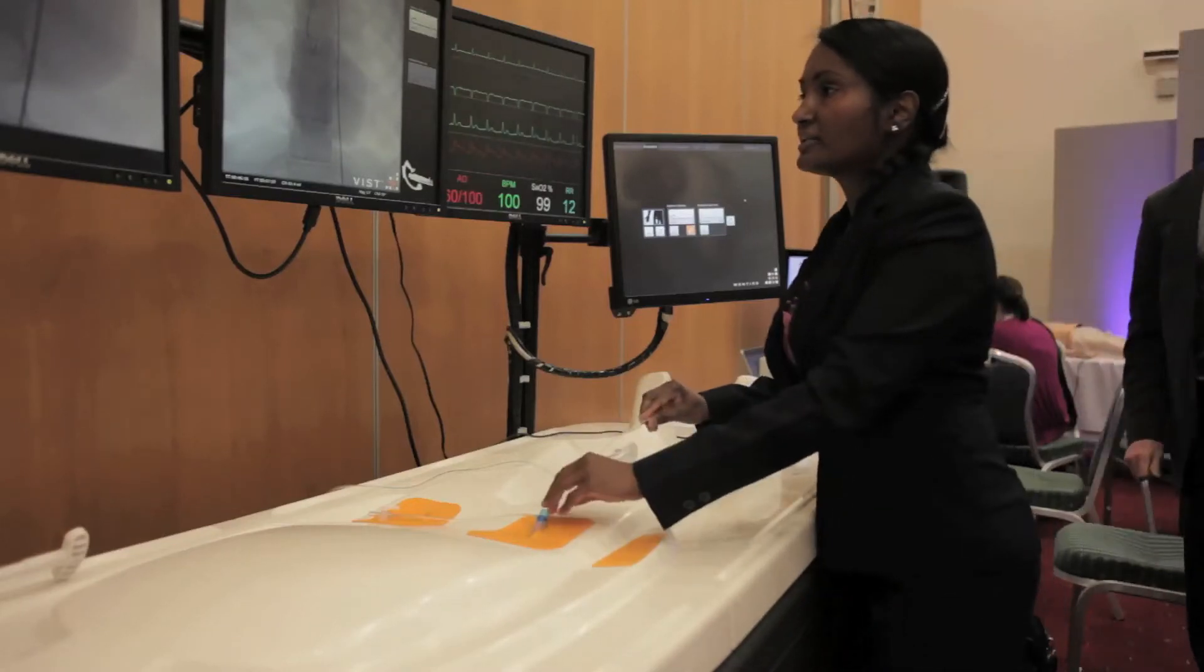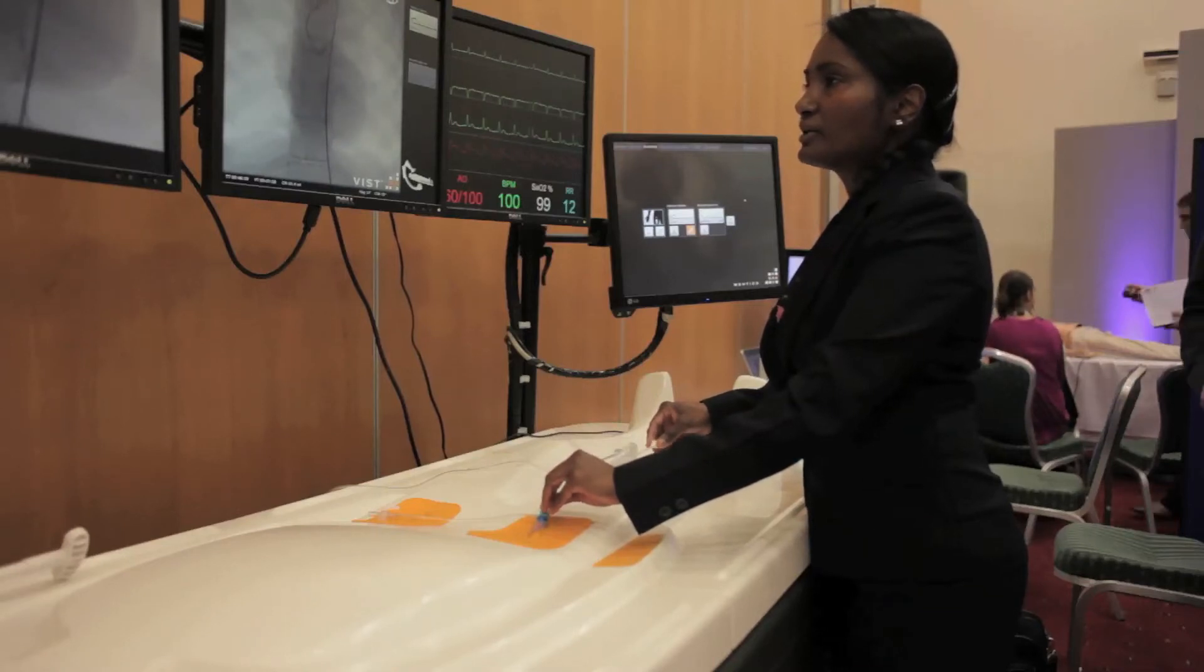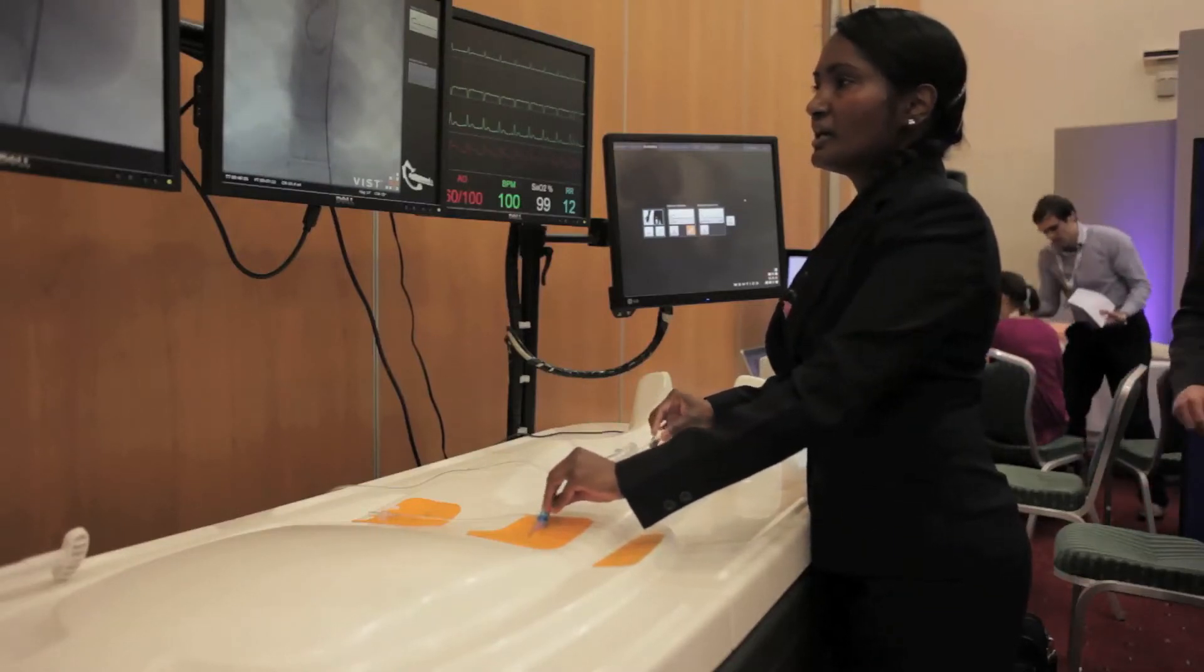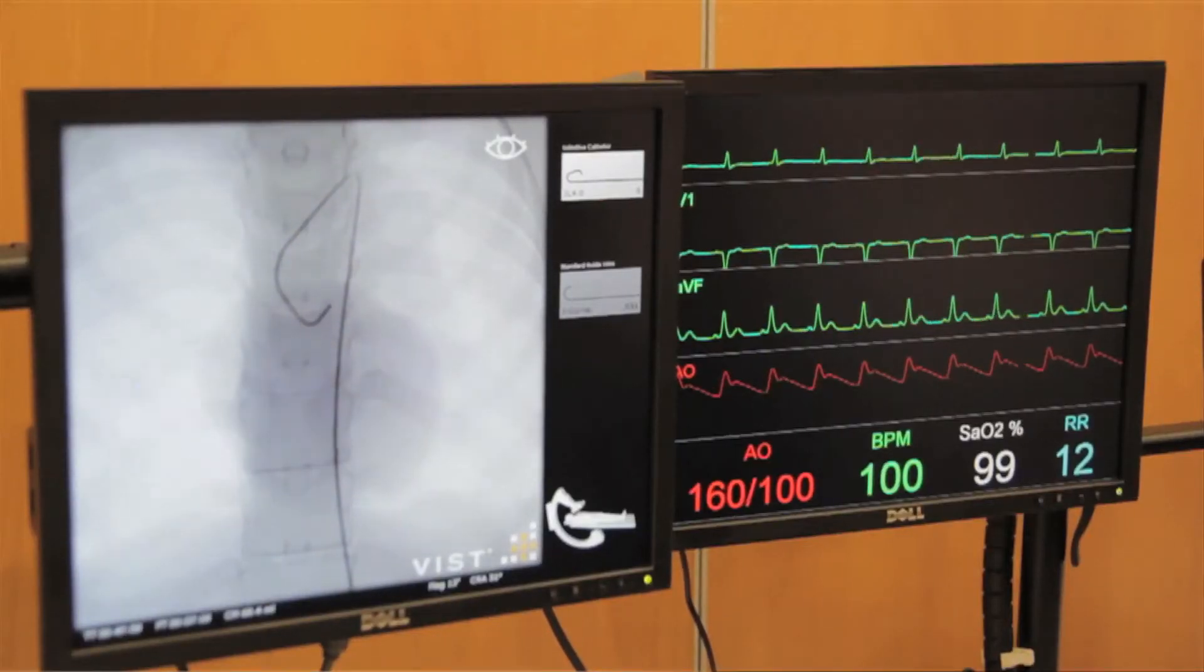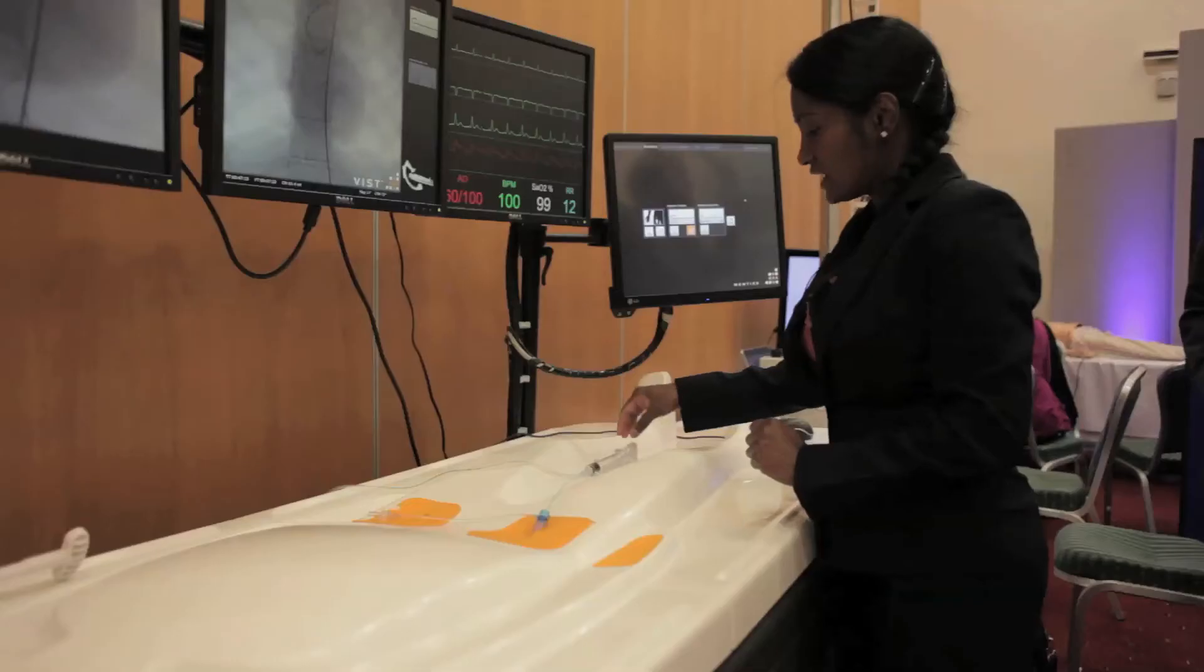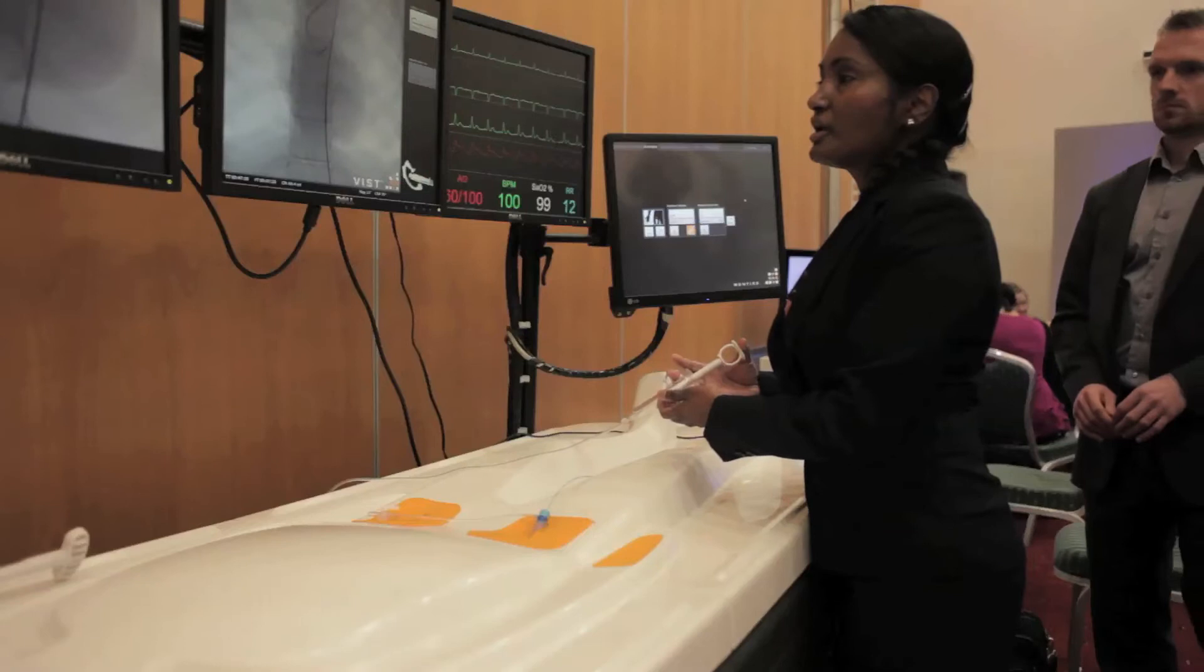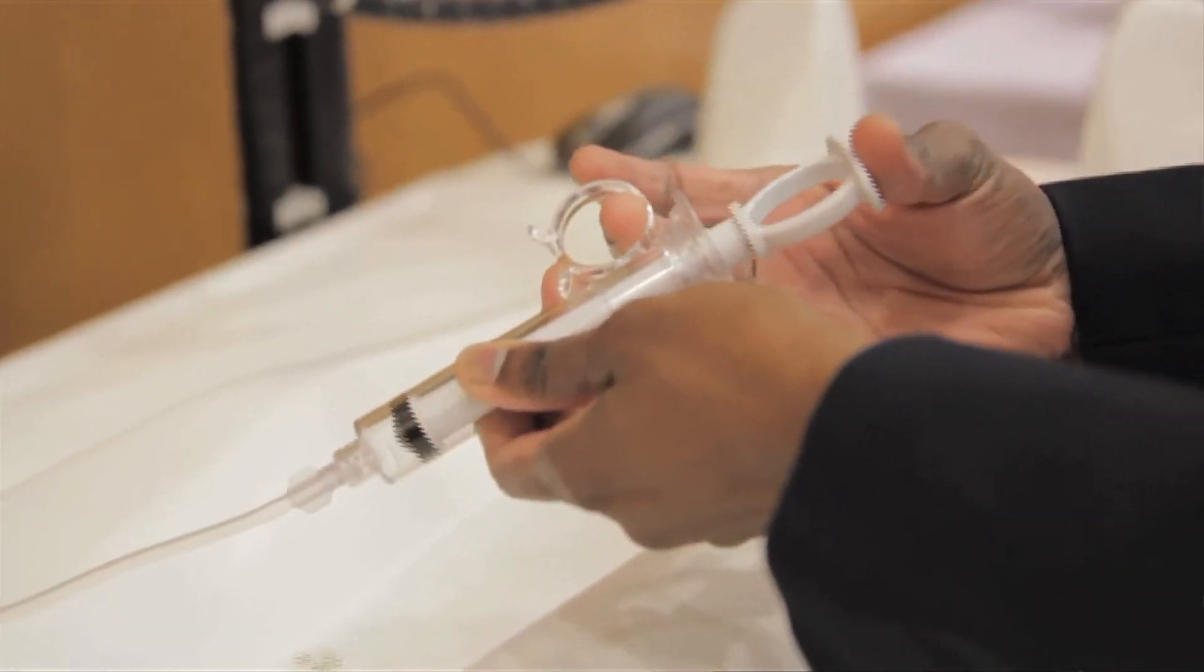And then try and engage the catheter into the left coronary sinus. We are now into the left coronary sinus, so it is a forward movement of the catheter in order to get the tip of the left catheter, which we are using is the Judkins left 4 catheter. It is now sitting well within the left main stem, and we do a test injection to confirm the position of the tip of the catheter in the left main stem.